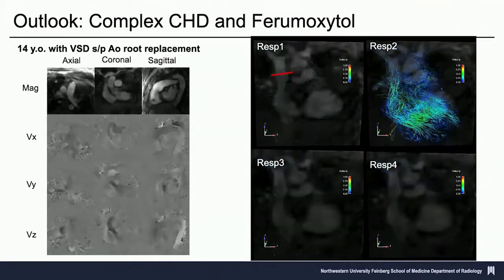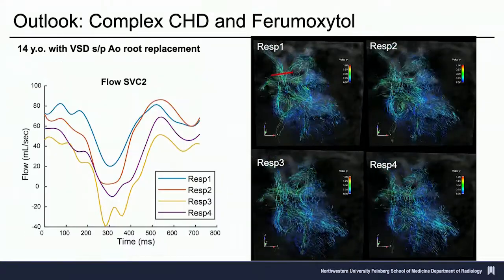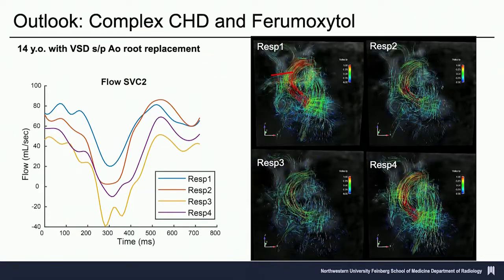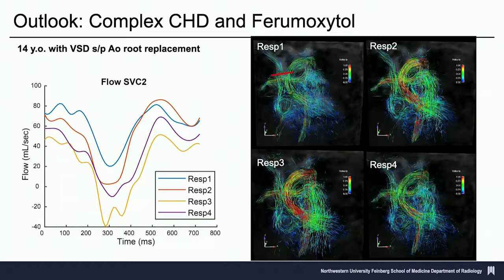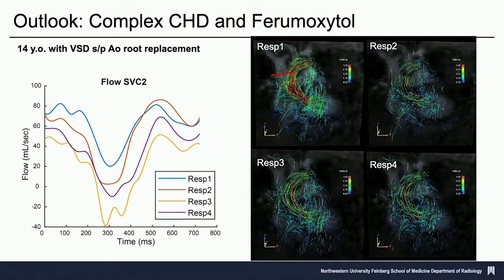And then we did some respiratory resolved visualization and placed these caval planes again. And it's interesting because in this patient, you actually do note some pretty noticeable respiratory changes, but we're still looking at this with a bigger cohort.